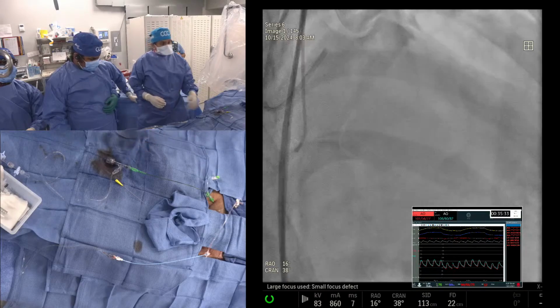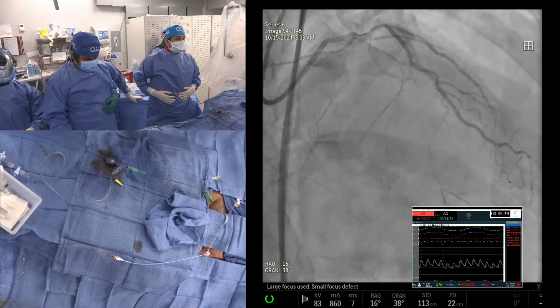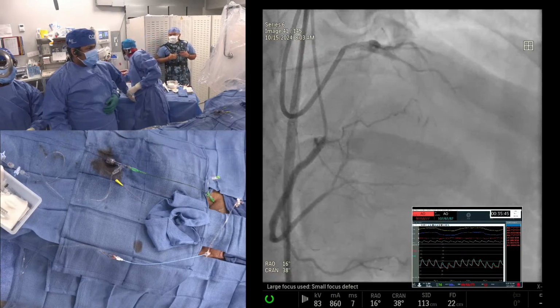So what is your choice? As soon as you bring your catheter there with a Fielder, what is your next wire you're going to ask for? I will go with Miracle. But if somebody says they want Gaia 2 or 3, that's okay too. Go with Miracle 6.